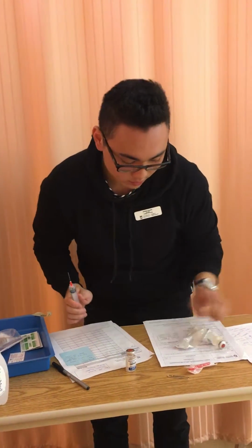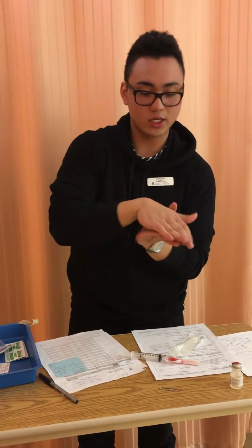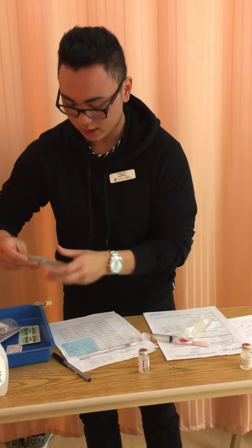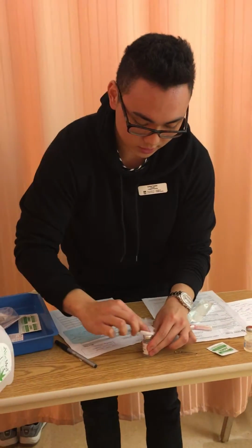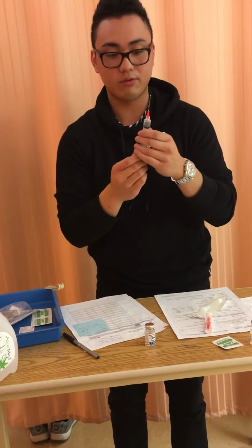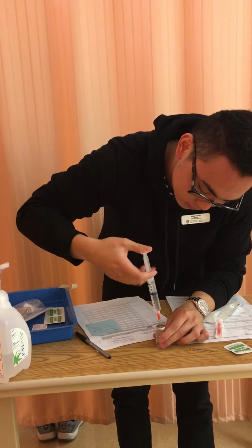And now, according to our calculations, we need to draw 7.9 milliliters from there, but first we would need to mix up the medication and roll it just to make sure all the medication is mixed very well. And before we draw that 7.9, we'd have to swab it again just to make sure it's sterile. Okay, 30 seconds has passed, and now we will draw that 7.9, but first we have to draw approximately 7.9 milliliters of air to help with the suction.